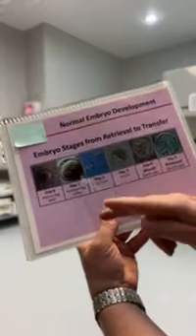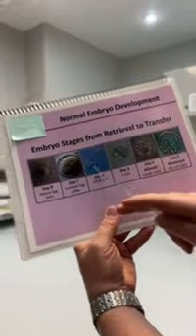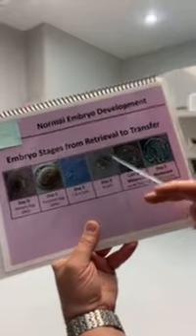And they are cultured up until the 5th day. Culturing them until the 5th day really allows them to sort themselves out into which ones are more likely to be able to make a pregnancy. Looking at the embryo stages, they start to divide on the 1st and 2nd day. By the 3rd day, they have about 8 cells.